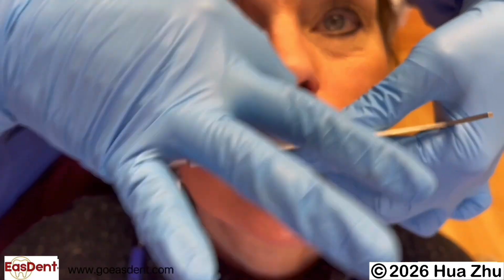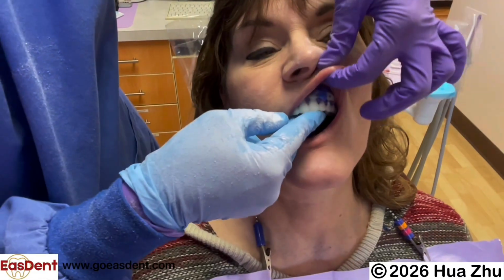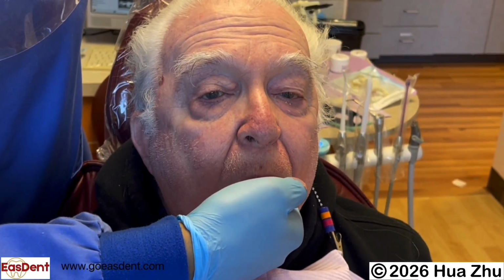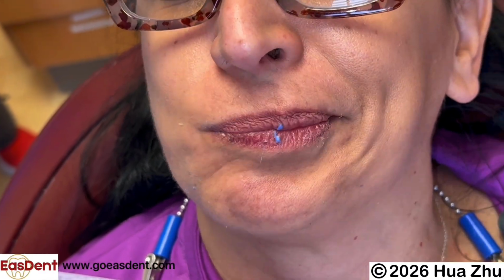Too thick putty material will be difficult to be molded by the lip. It is okay to be a little short at the border now by pulling the patient's lip with your finger. Border molding later will catch the functional border. Mold the rest of the material with various lip movements.